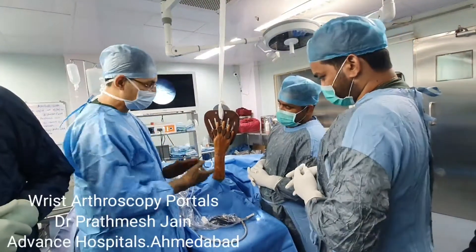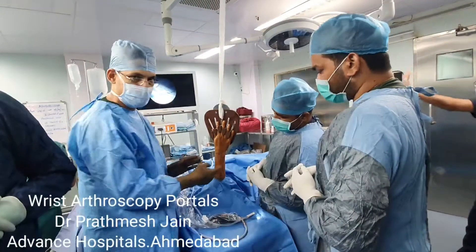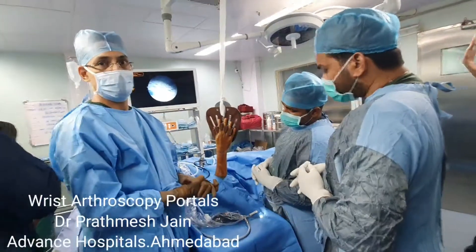There are two spaces to work on. The first space is the radiocarpal space and the second space is the mid-carpal space.